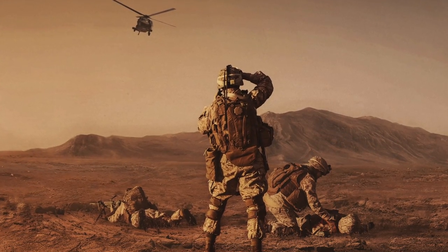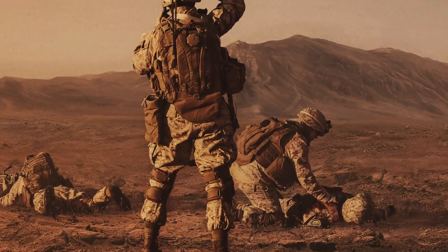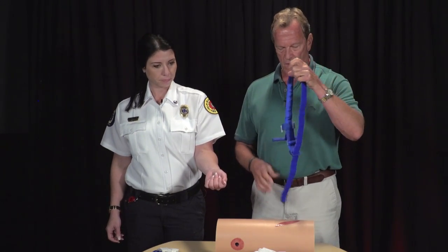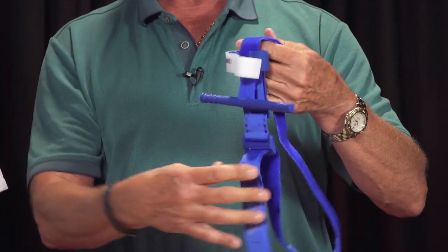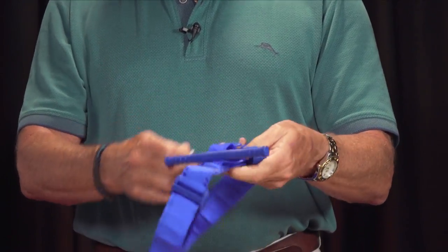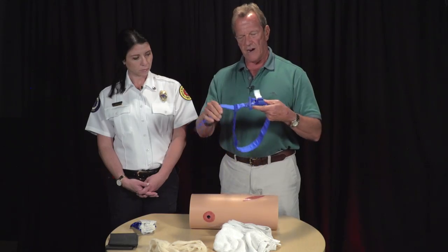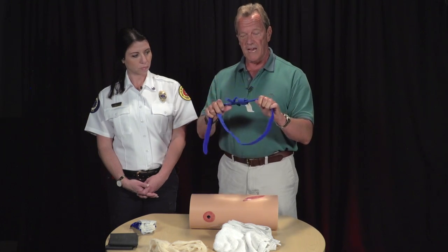Every soldier is issued these tourniquets, and they can be applied to yourself with one hand or used on others. It consists of a Velcro self-adhering loop, a windlass rod, a small clip to hold the rod, and a strap that attaches over it and locks it into place. Very simple but very effective. Once it's in place, it doesn't come off — and that's the problem with makeshift tourniquets: they tend to get loose.